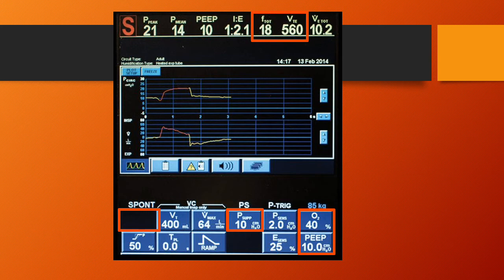When you're looking at a ventilator as a nurse, you're really looking at whether the numbers are a little higher or more on the low side, because a lot of that's going to tell you how much support the patient is receiving. What is my goal for them today? Is my goal today to get this tube out? Is my goal today to wean the ventilator further, maybe decrease some of these settings? Is my goal today just to support the patient with whatever they're fighting right now and decrease that workload for them? What is my goal?